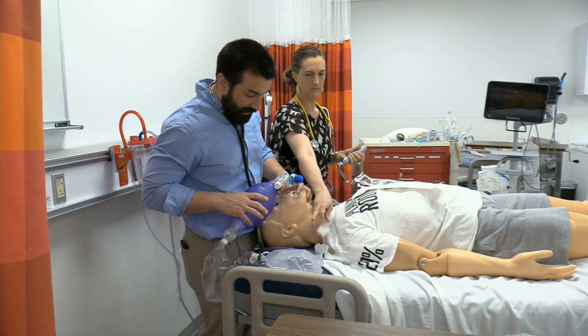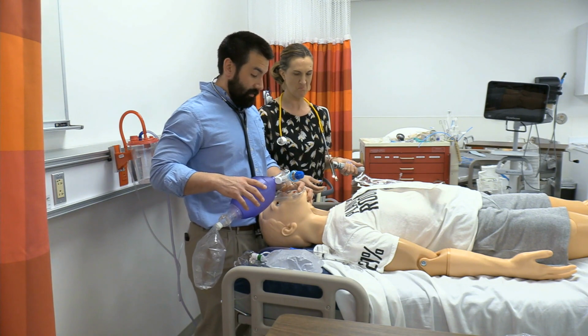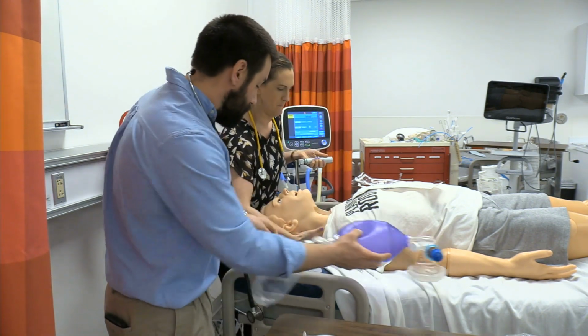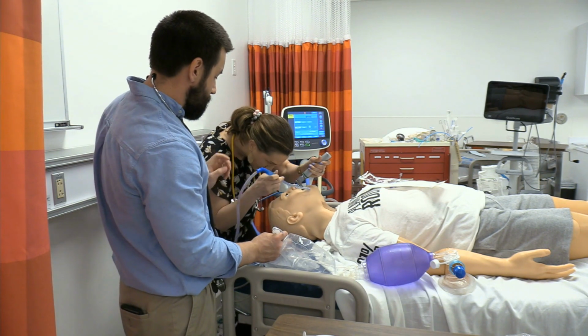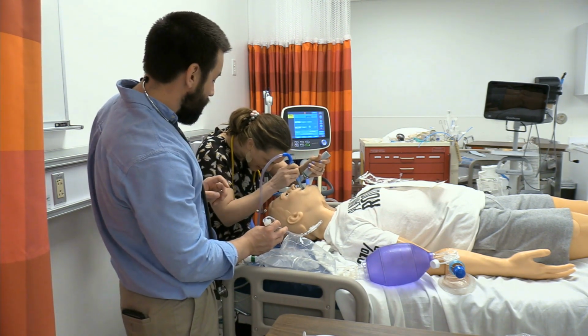She's got her tube checked, ready to go. We got CO2. I think we sucked out a bunch of stuff. You ready? Yep. All right, so I'm going to take the bag over to my side. I'm going to pull that oral airway. Let me know whatever you need. Suction, please. Oh, I gave her a complex. She's not making the noise. Oh, there she goes.